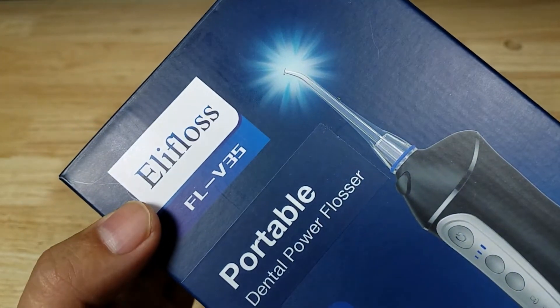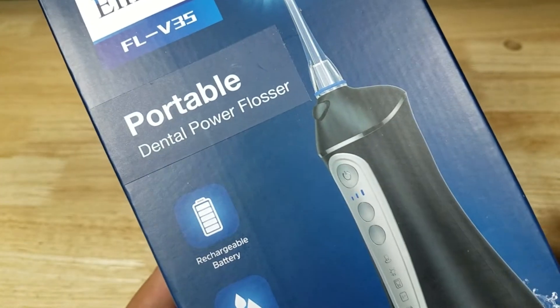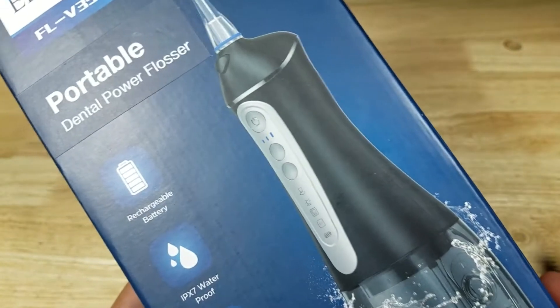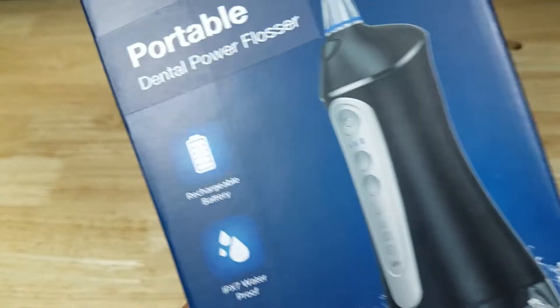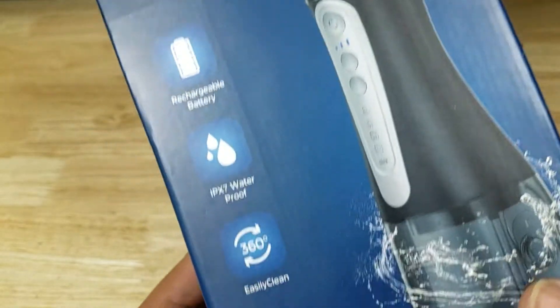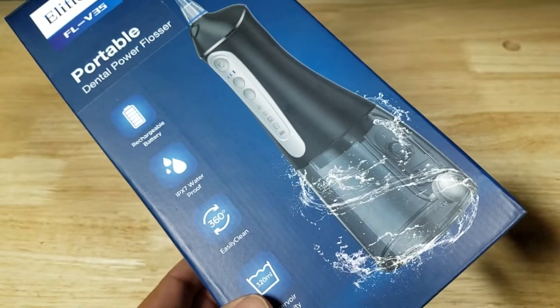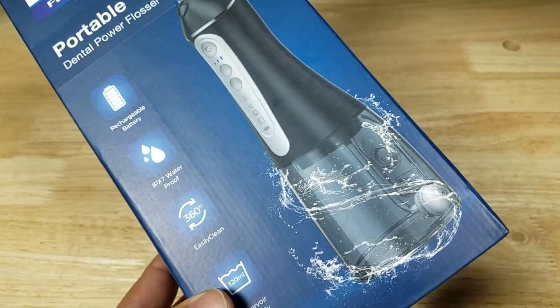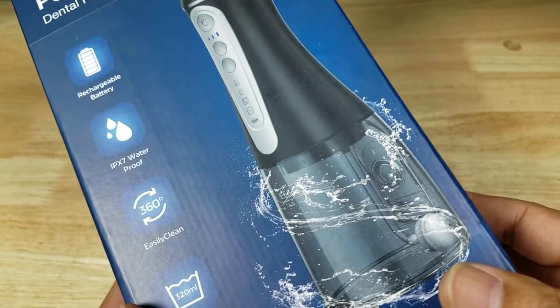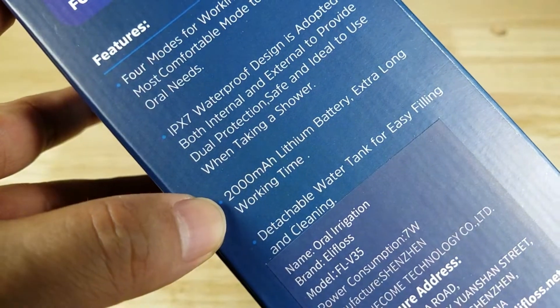Here's a closer look — I'm going to pronounce that Eli Floss, model number FLV35. This is a portable dental flosser and it's cordless, so it's rechargeable. It has an IPX7 waterproof rating, meaning it can be submerged underwater one meter for 30 minutes. You have a 360-degree nozzle that turns all the way around, and the water tank is 320 milliliters. For me, I can get my whole mouth done in one tank, though if you really take your time you might have to fill it twice. Battery size is 2000 milliamps and they say it can last about three weeks, depending on how much you use it.